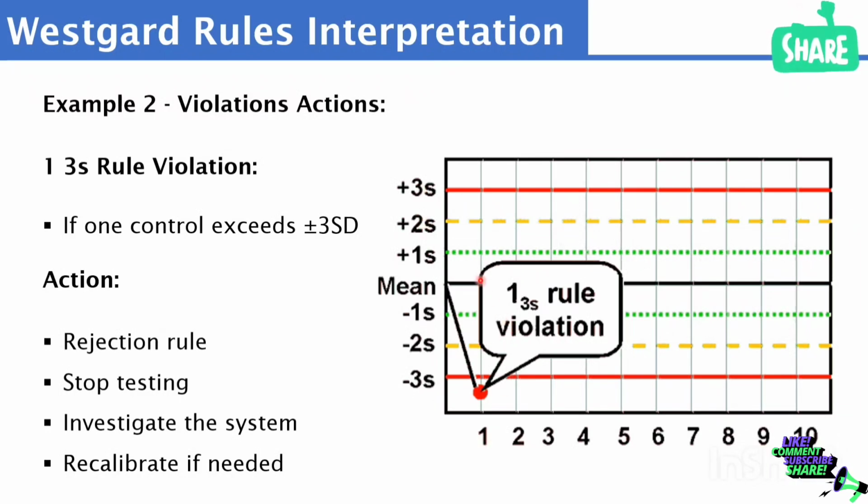Remember, the mean is here. Look at how far it is from the mean. Very far from the mean. That is what you should be considering. So you can tell them during the interview that this is what the 1-3S rule is.